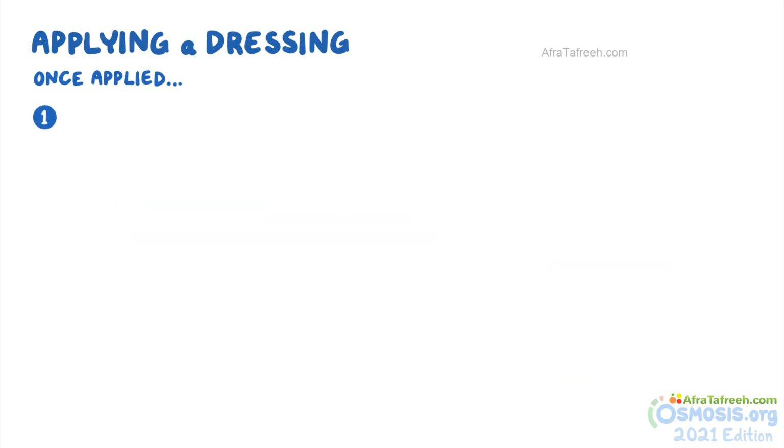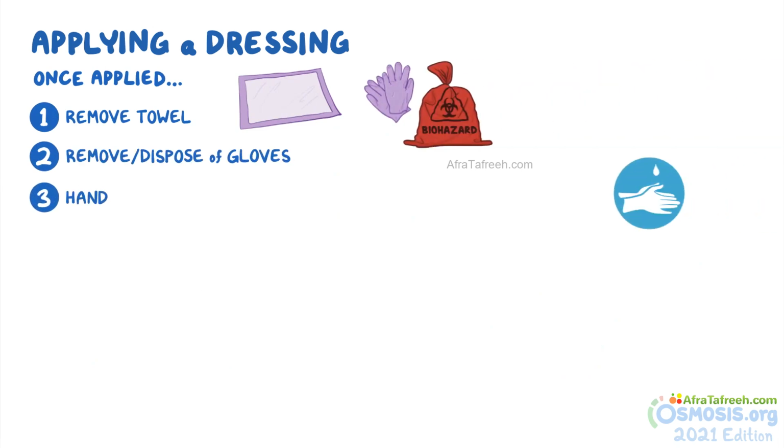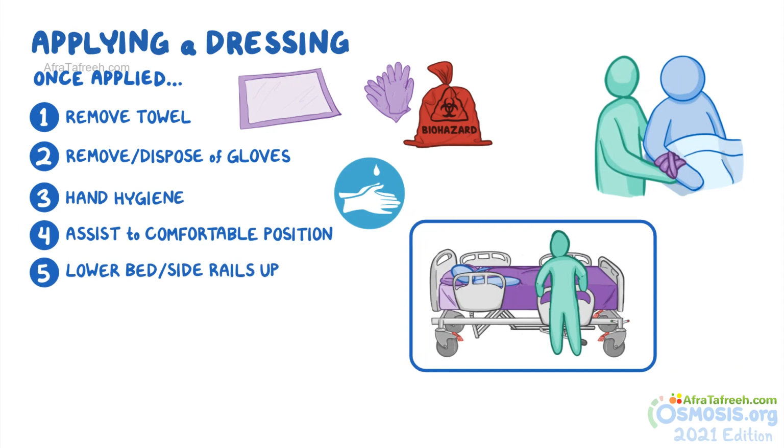Now that you have applied the dressing, remove the towel, remove and dispose of your gloves, and practice hand hygiene. Assist the client to a comfortable position, lower the bed, and put the side rails up. Finally, return supplies to their proper place.